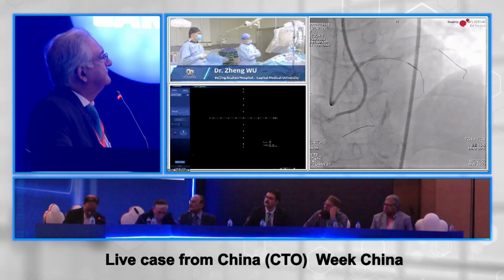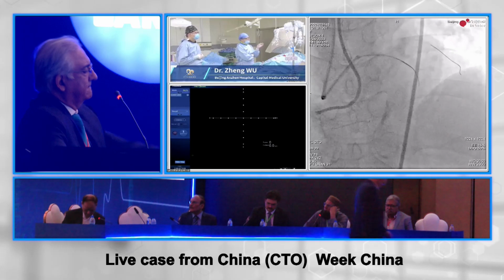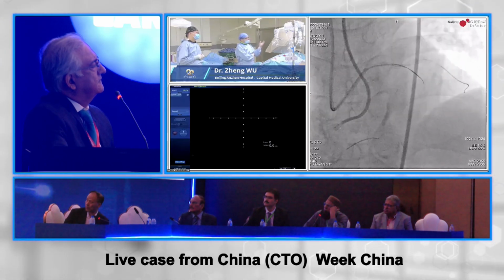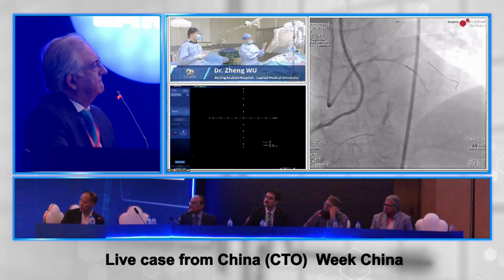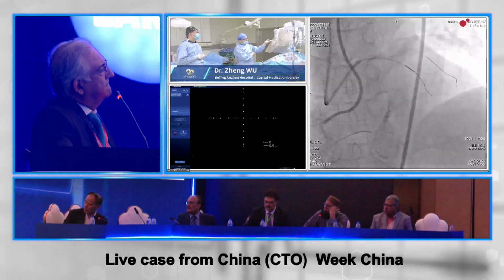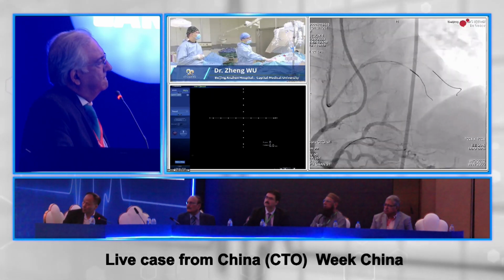Yeah, I didn't use a Gaia series wire just because there is a calcification. The main reason is calcification. I don't think the Gaia series wire in severe calcification will be a good choice because it can get stuck by the lesion. And I can see there is maybe some channel, and just because of the severe calcification, I escalated the wire. Also, I chose a polymer jacket wire from the Fielder XT-A to the Pilot 200 because Pilot 200 has more powerful penetration compared with Fielder XT-A. And after that, you can see that the Pilot 200 can go through to the other diagonal. I think this diagonal is bigger than the previous one.